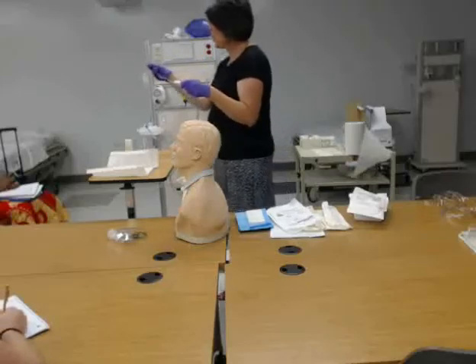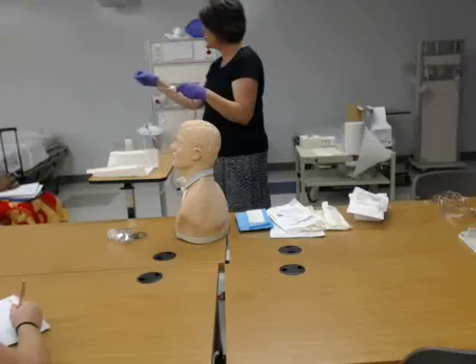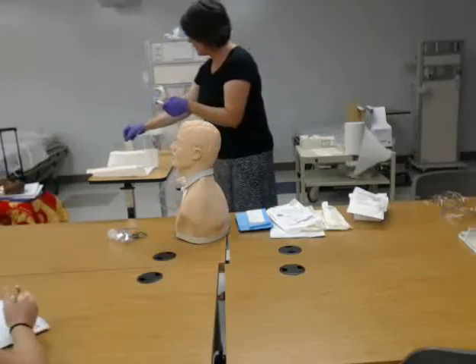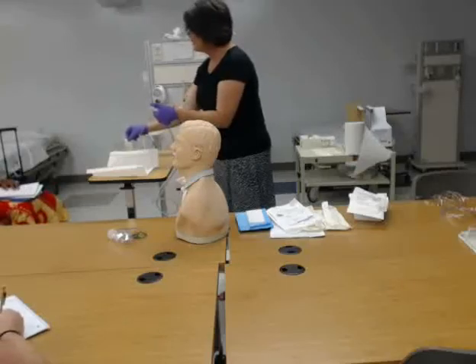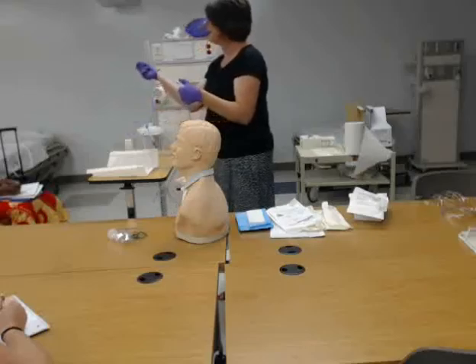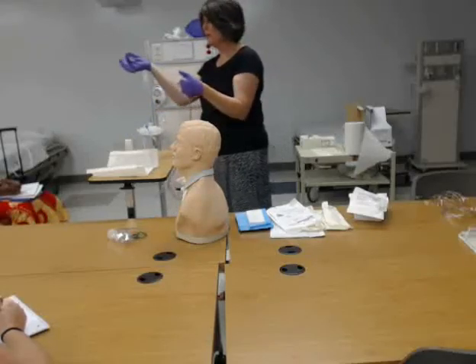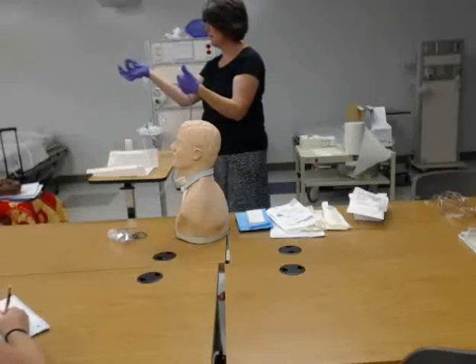What I want to do to start is not only test that my suction is working, but also lubricate the end of my catheter tip before I put it in. So I put it in my saline, put my finger over the hole, and it draws up the saline and gets it to the end of the catheter. When my finger is over the hole it sucks; when my finger is off the hole it doesn't suck.